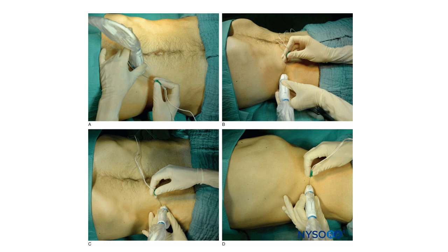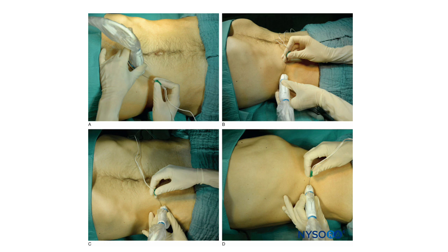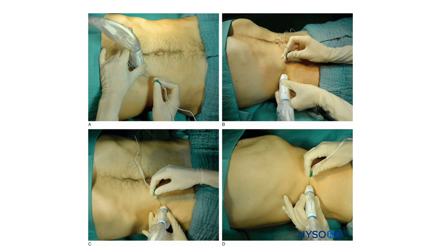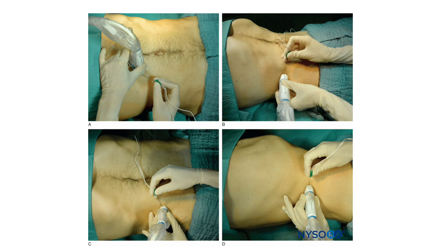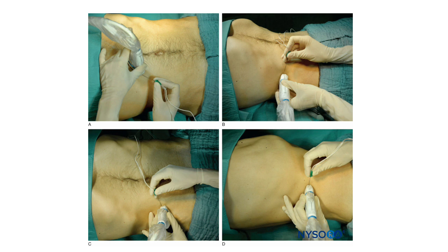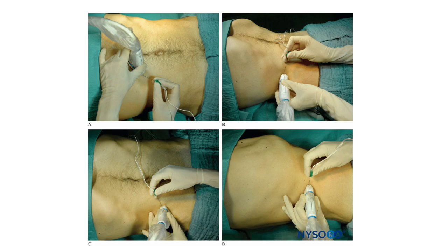Here is a picture summarizing probe positioning: the upper left is the subcostal block, the upper right and lower right are lateral TAP blocks, and the bottom left shows probe positioning for a rectus sheath block.